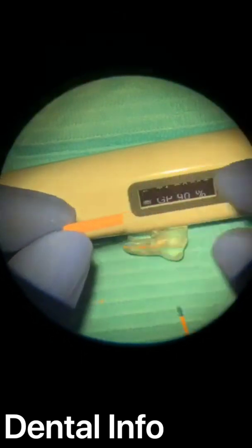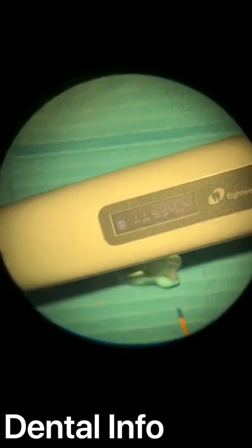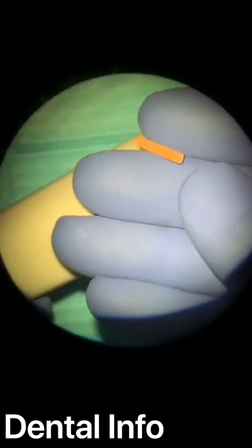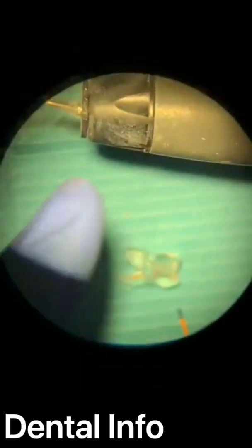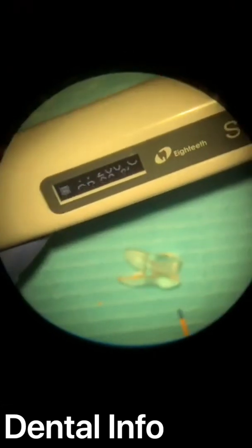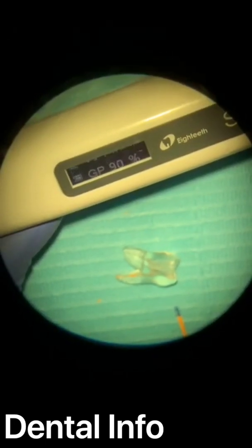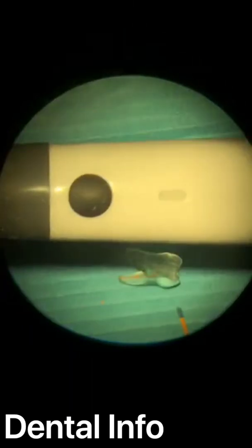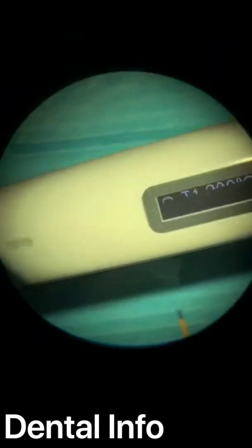So you don't have to pay a lot of money to buy extra tips like in other devices. They have their own tips, and the tips are very expensive. So you are just taking these bars and putting them inside here. You open this out and put the bar here. Fortunately, here we have good gutta percha. Every bar like this is enough for like 3 molars, 3 to 4 molars, let's say 10 to 12 canals, and that's fair enough.